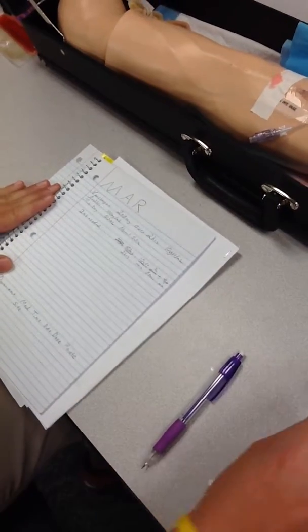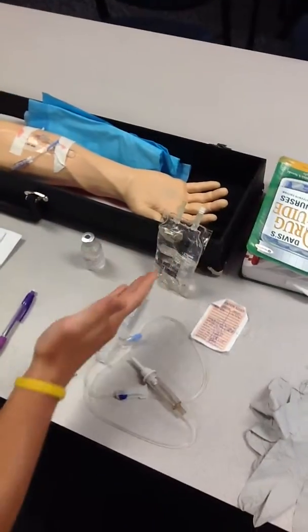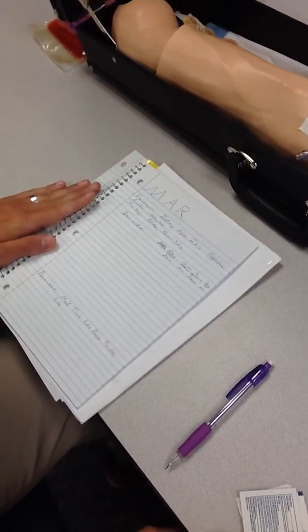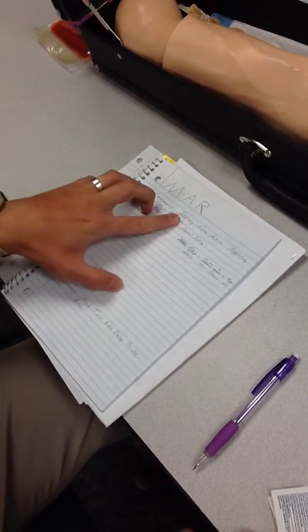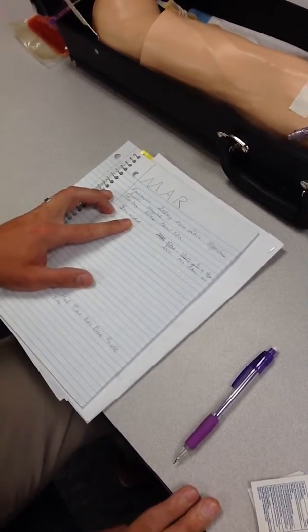My MAR calls for 200 milligrams of vancomycin administered over 2 hours. We will be using a Minibag, which is a 50 milliliter sterile normal saline solution that we'll inject the vancomycin into. It's available in 100 milligrams per milliliter, so we need 200 milligrams, so we will be taking 2 milliliters of vancomycin today.